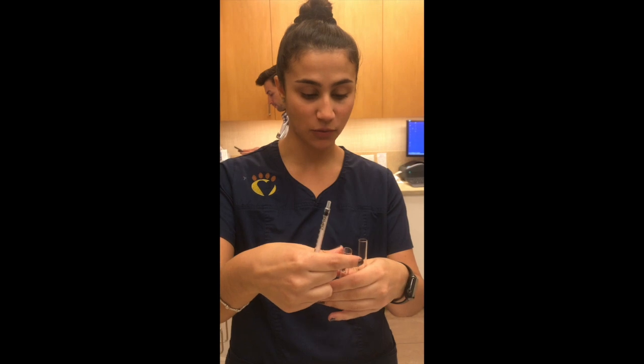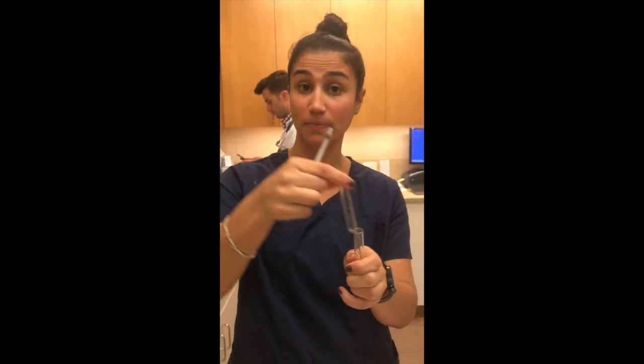Now I have my 2% erythrocyte suspension from our donor and our recipient. Okay, so now I'm going to be making the major cross match. So first I have my donor cell suspension here. I'm going to add 2 drops into a new test tube, which I labeled major.